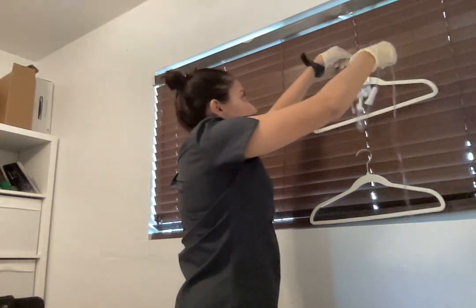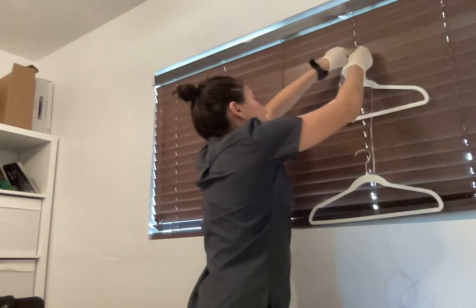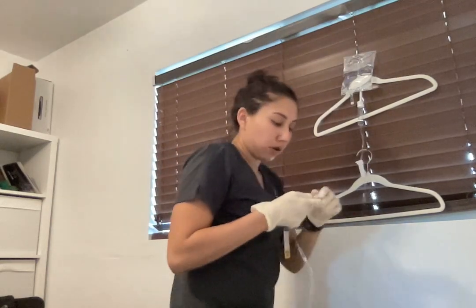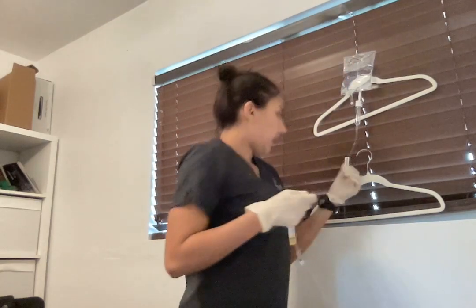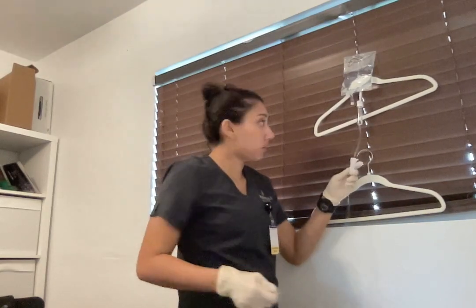You want to hang it at least 30 inches from the patient. Okay. From here, I'm going to remove the cap on this port that would go into the IV of the patient, and I'm going to release the clamp here so fluid can go through the tubing to release any air bubbles.